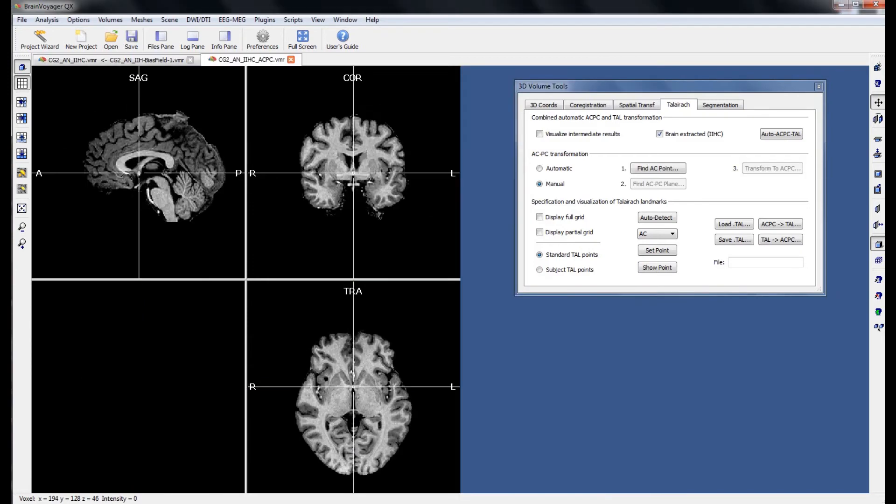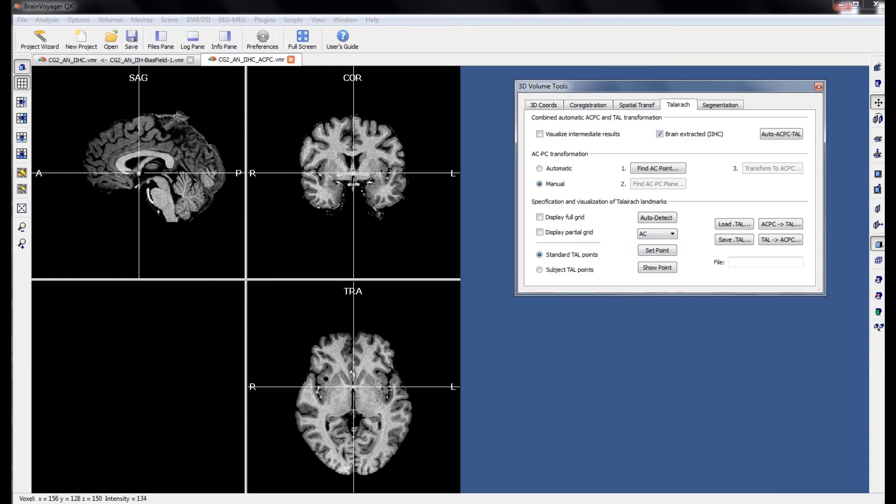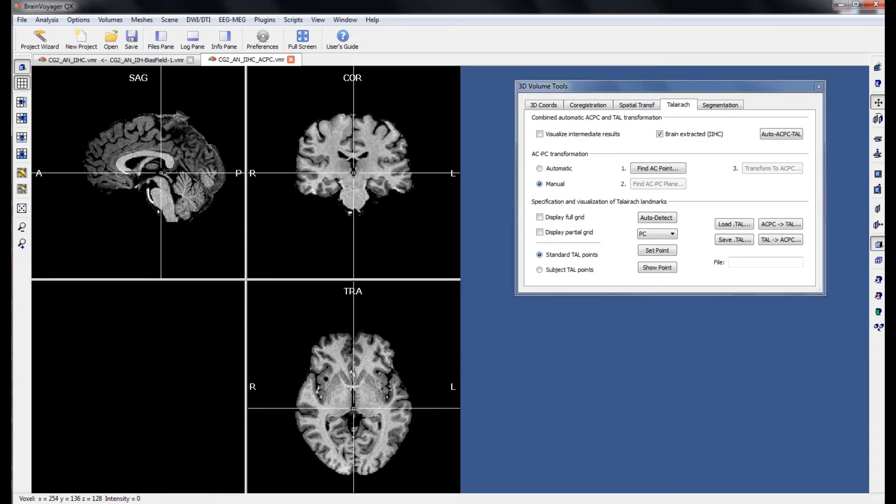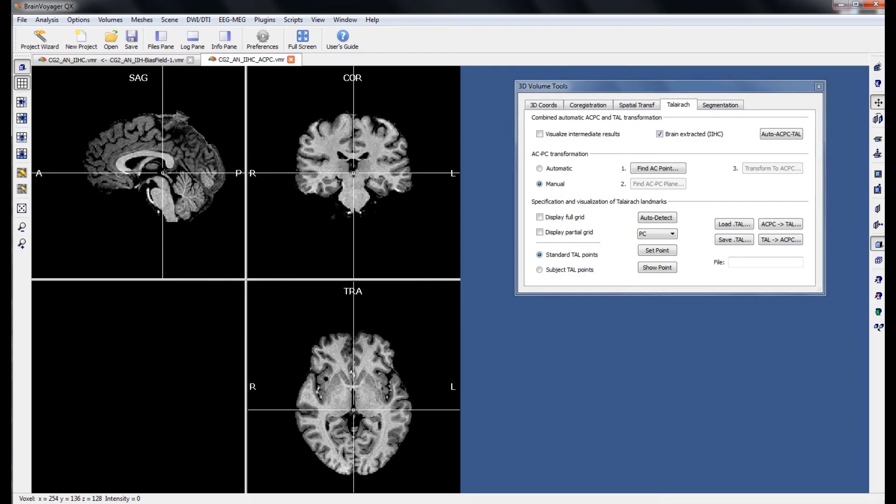When this is complete, the next step is to identify the landmarks which allow us to transform the brain from ACPC space to Talairach space. These landmarks are a number of points around the brain defining the brain's boundaries. The AC point is already well defined, so the first point we have to define is the PC point. Using shift and the down arrow, we can move the cursor until it rests on the bridge defining the posterior commissure.